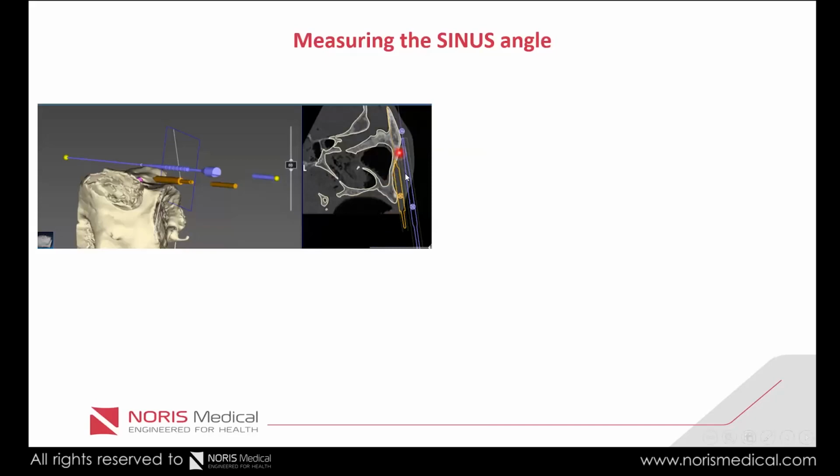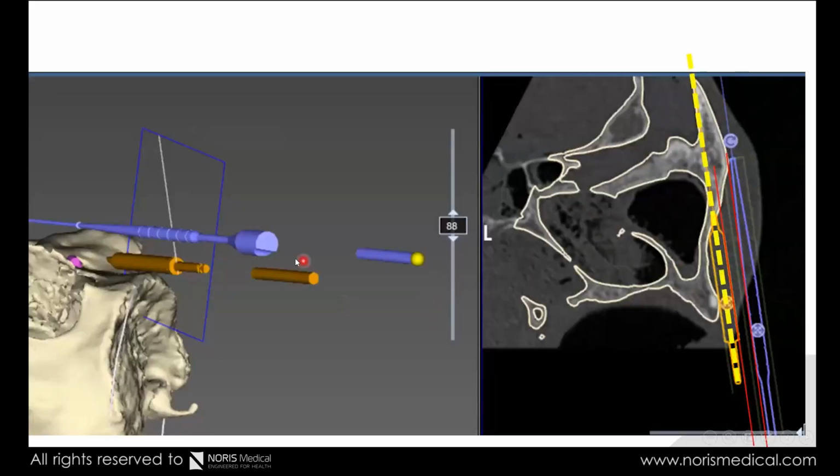So basically we start at this position, okay? We put the diamond, but what we see here, if we continue, we don't know that, okay? We know this only by the fact that we have the distance between these two lines. If we see the distance too high, that means that we are actually going to be out of the bone, because we know this before, okay? This is how it looks, okay?